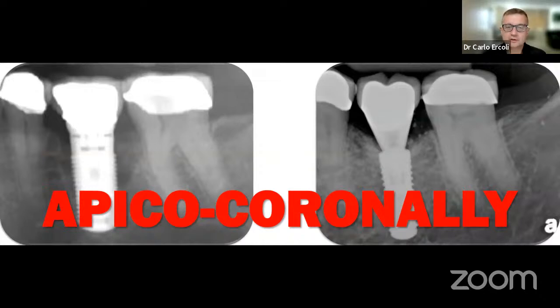So it becomes a little different, however, when we look at this restoration. Now we're thinking, well, where do we place them from an apicocoronal standpoint? Of course, we don't want to place them too deep, but at the same time, we'll see often, we don't want to place them too shallow because there are a number of drawbacks that come with it.